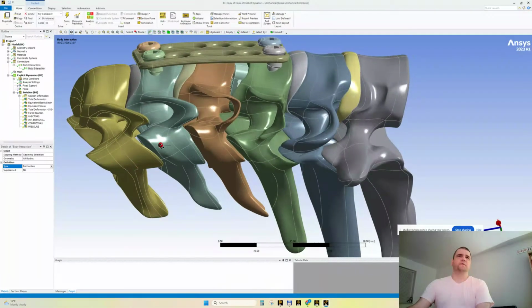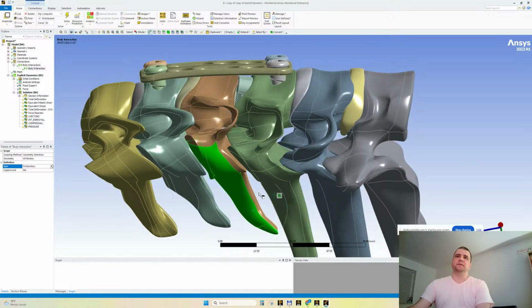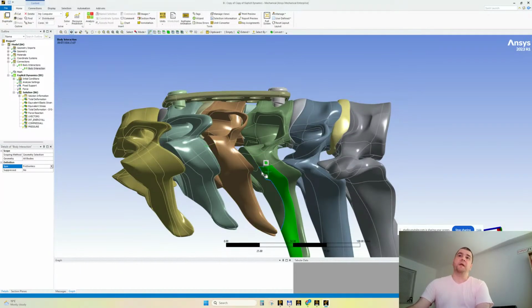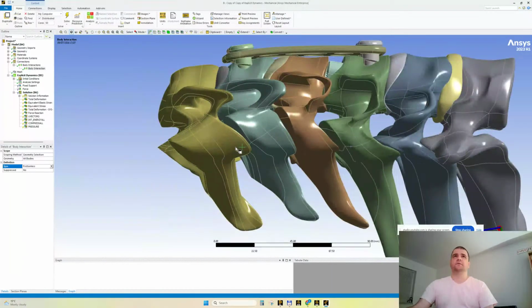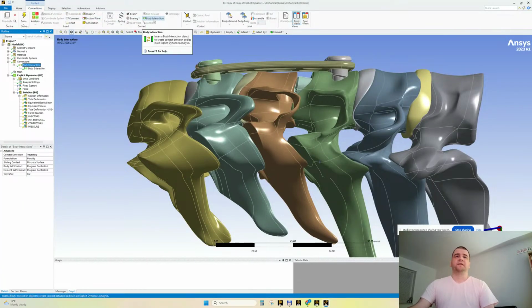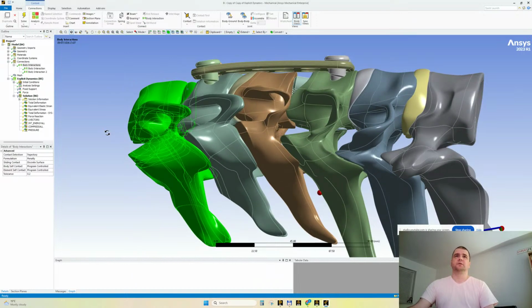Yes, but it will remove this possibility of having a very nice touching, especially maybe in the middle, where we have maybe a touching, I don't know. So let's keep them as they are. Then define contact pairs. So for example, everything from now on will be bonded, in my opinion. So bodies, this one with this one will be bonded.